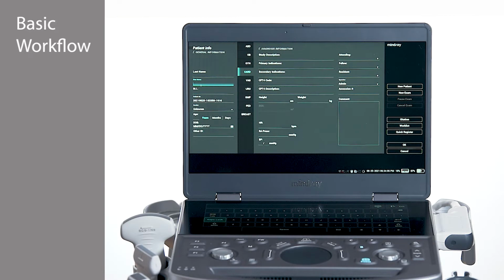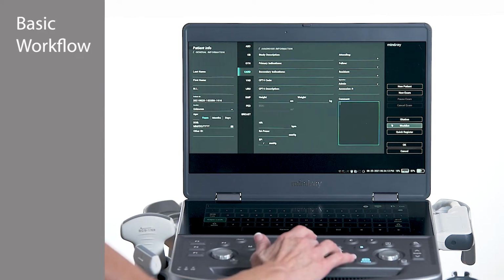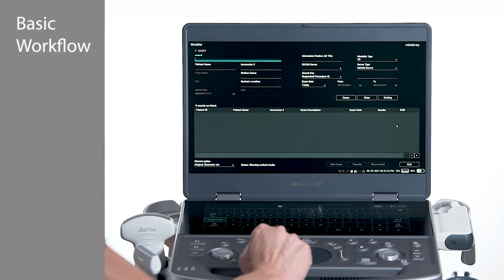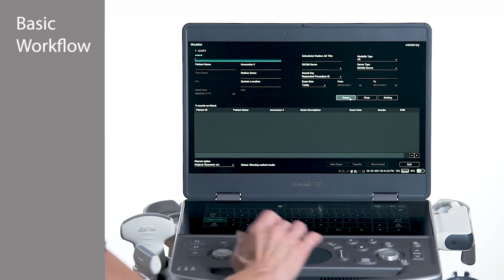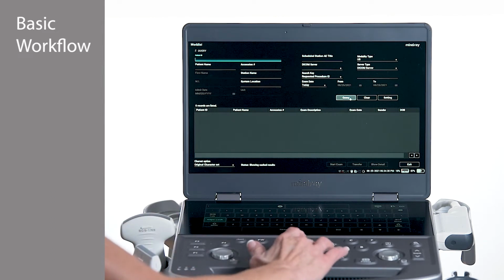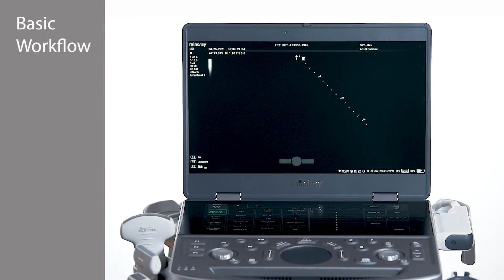If purchased, a barcode scanner can be used to scan a patient's wristband, or a DICOM work list can be queried. If applicable, both of these options will be set up by an application specialist upon installation of the system. To query a work list, simply select the Work List tab on the right of the patient data screen and click Query. A list of patients will appear to choose from, or manually input search parameters at the top of the page. Choose the desired patient or select OK once all information has been entered in the demographic page.